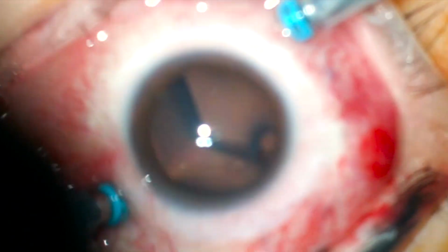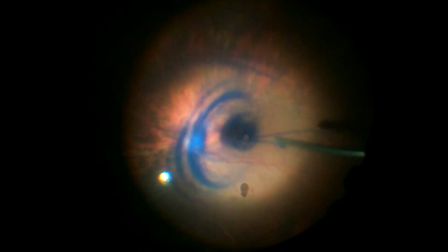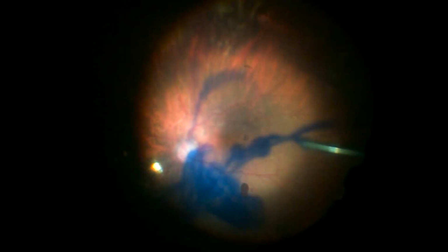The surgeon first removes the silicone oil. Next, brilliant blue dye is injected, and internal limiting membrane peeling is performed.